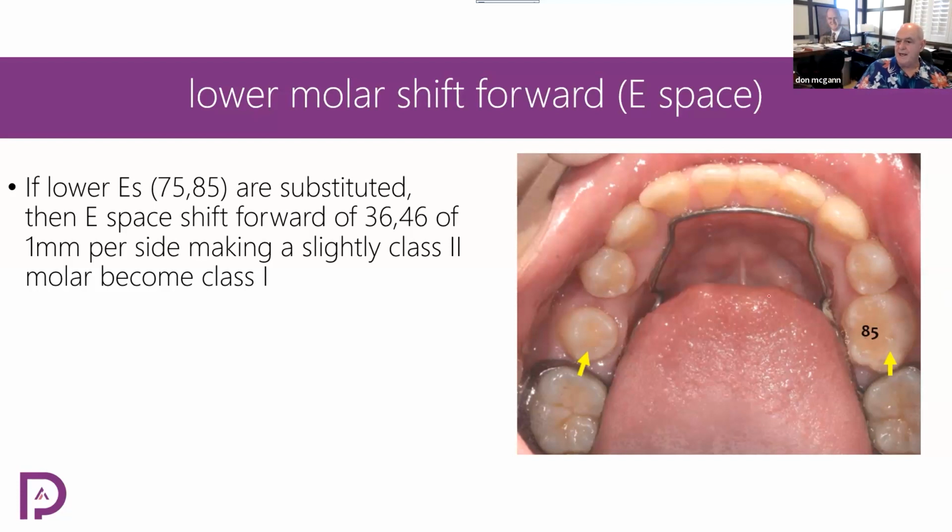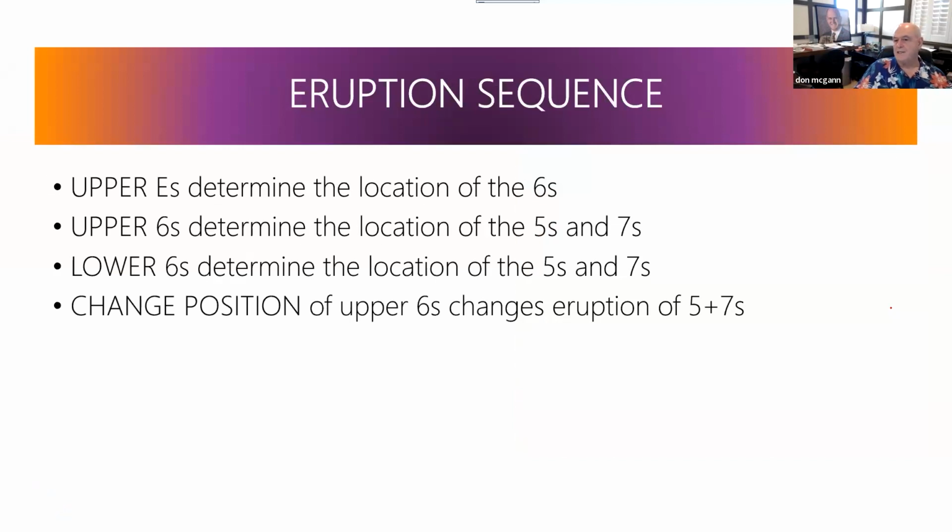What you're going to get is, you're going to ask for an eruption bubble where this space is. You're going to say, I don't want, or I do want, either way. I want the molar to shift forward or not. And if you make an aligner over this primary molar, well, you've already got a bubble. There's a bubble there right now. If that tooth falls out, you have a void representing that tooth that was previously there. Okay? You get that? So in the instructions of the aligner, they can program it either way you want. You just have to tell them the way you want it.